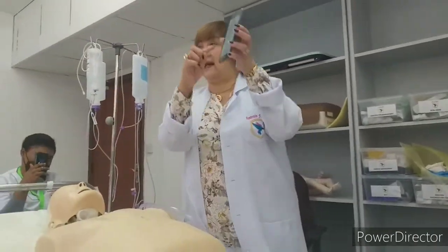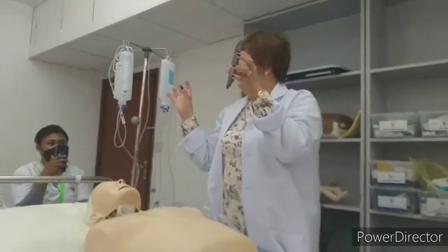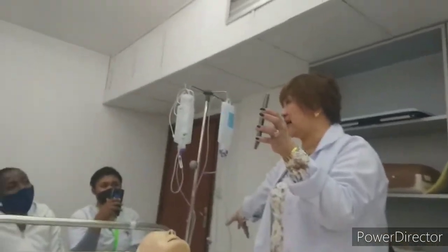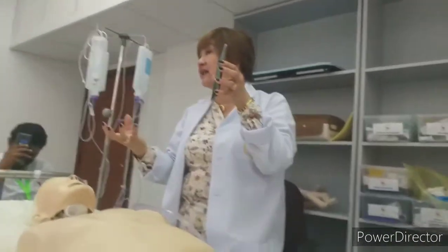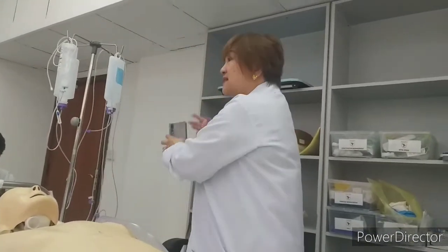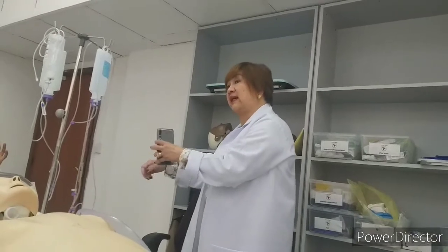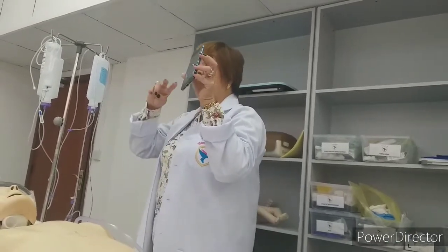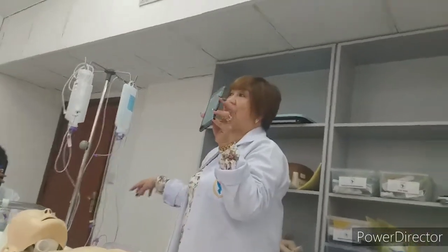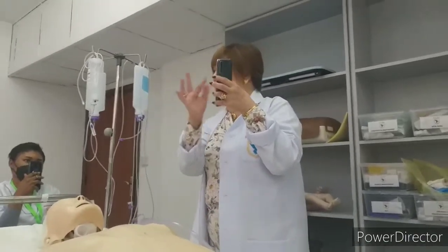Okay? So if you prepare it like this with a disposable plastic liner inside, you have to dispose of it in the medical waste. But if there is only a bottle without the plastic container inside, you need to wash it, throw the secretions and contents inside the toilet bowl, flush it and clean the bottle. Okay, there are two ways. When you are leaving after your duty, you do not leave anything that is dirty in your unit. Make sure that everything is clean.